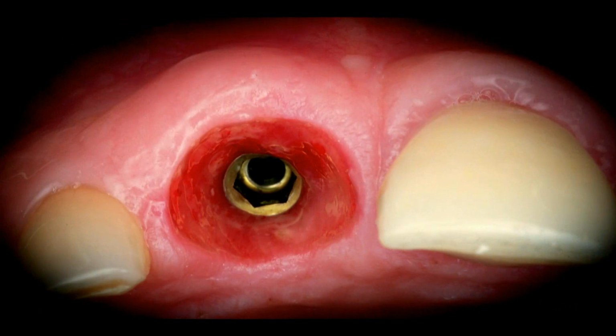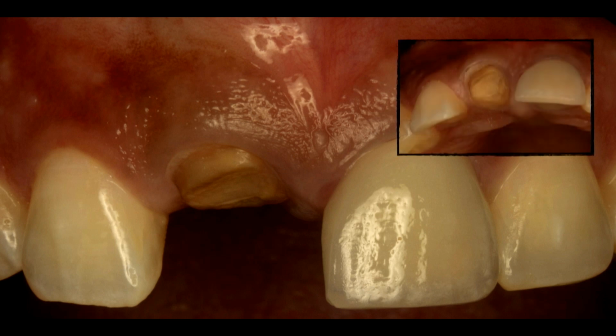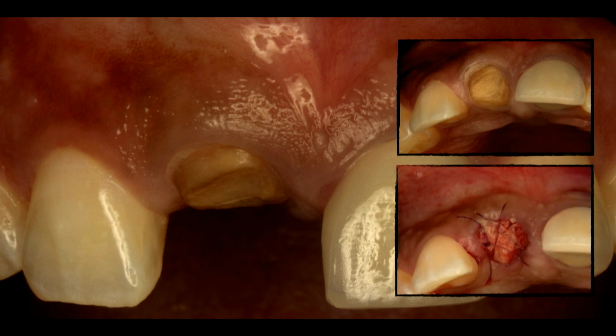Yeah, and as John mentioned, obviously our goal is always immediate placement when possible, even immediate loading in a lot of cases. And really the benefit of that is that beautiful soft tissue healing. Being able to maintain the soft tissue architecture is really our goal. But of course, in real life, that's not always possible, as John showed you. And so there was a point in my career where I would place implants in cases like this, didn't feel comfortable necessarily loading the implant, and I would just leave some particulate exposed, and that should do pretty well.